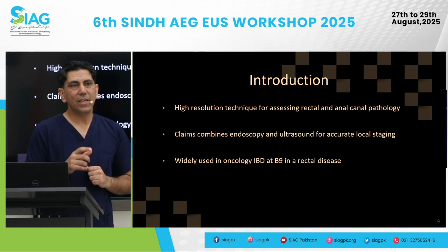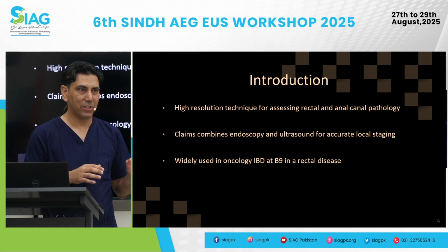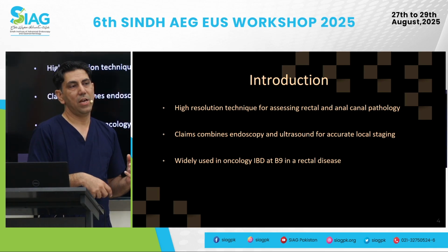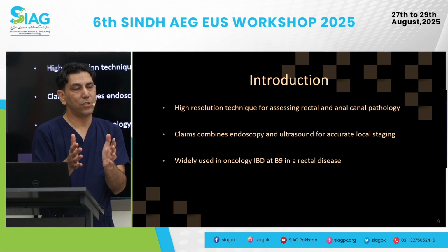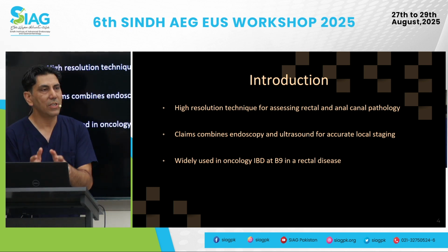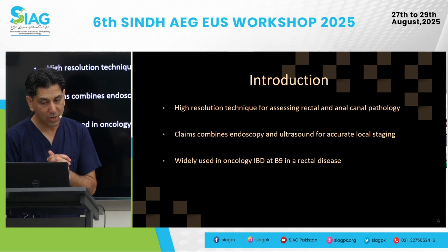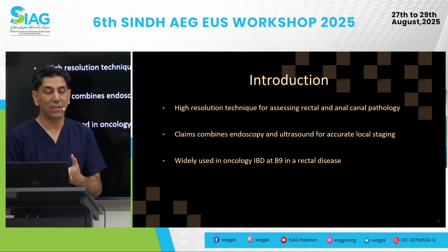Now, one of the areas where we've seen a lot of expansion is EUS in inflammatory bowel disease. We've also had patients who presented with cecal lesions where the endoscopist had to use a thin probe through the colonoscopic channel to visualize it. So there is an evolving field out there. If a person does not have major pancreaticobiliary interest, or is not a hepatologist or a gastroenterologist with upper GI pathologies, and has most interest in IBD, this is certainly a helpful tool. So you can be very useful to your oncological colleagues and also your colleagues who have an interest in inflammatory bowel disease.